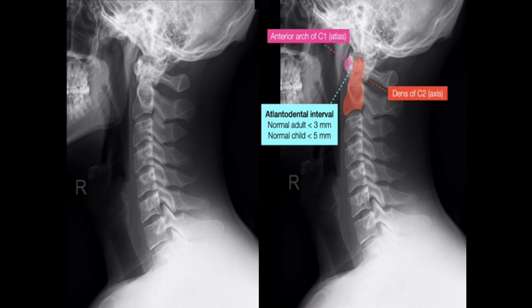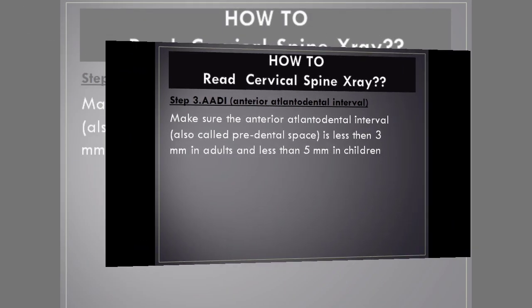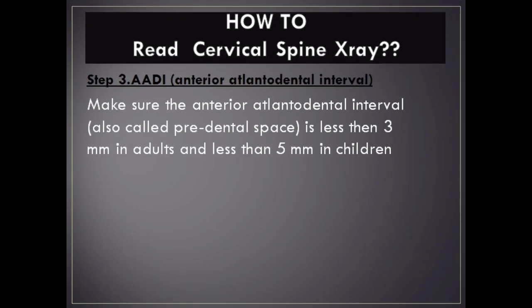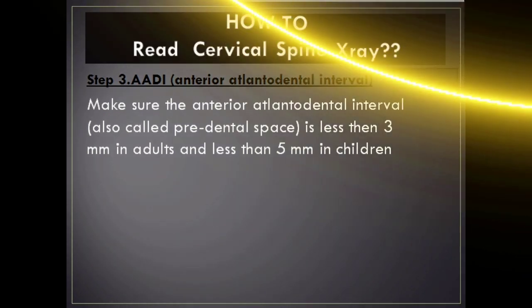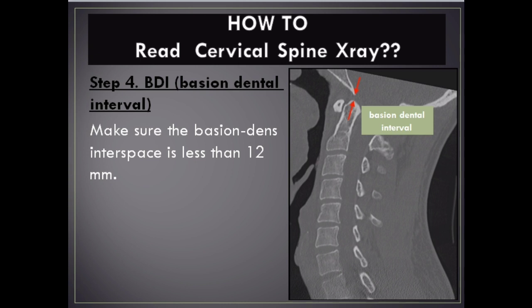Step 3 – AADI (Anterior Atlantodental Interval): Make sure the anterior atlantodental interval, also called the pre-dental space, is less than 3 mm in adults and less than 5 mm in children.